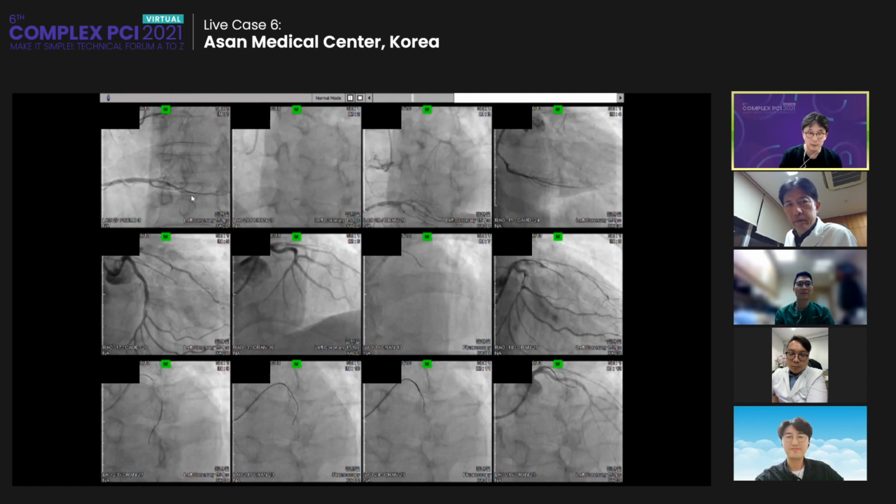So in this particular case, the very valuable information for me was the assessment of the proximal cap. If you remember the RAO cranial view, the morphology of the cap was a little bit weird, right? We have a tapered tip and there was a bump there, but in this CT, the tapered portion was exactly at the mid portion of the CTO segment.